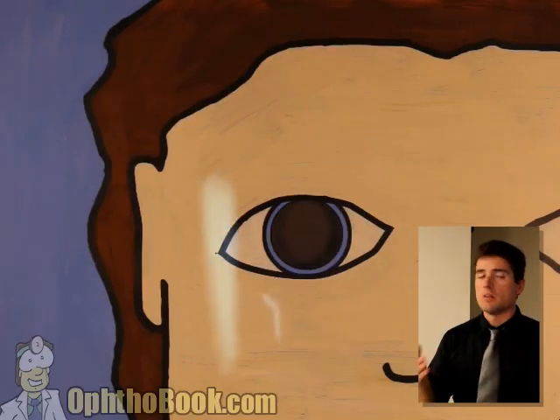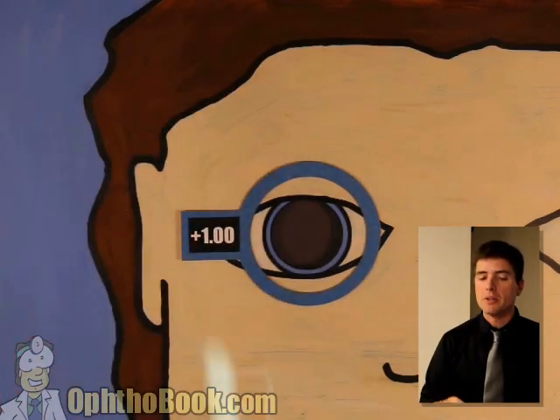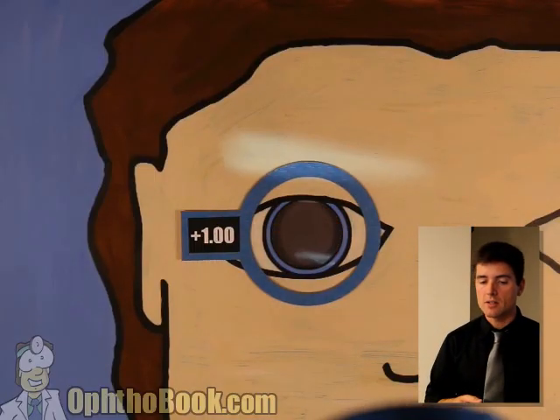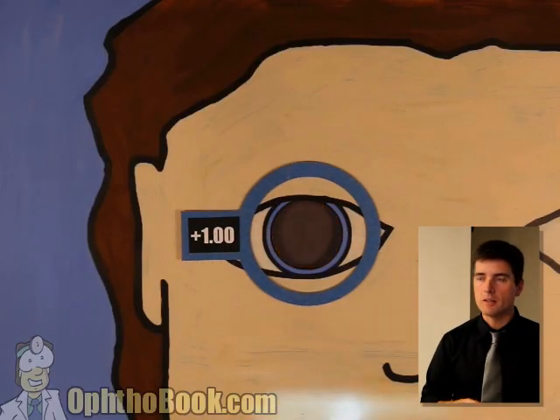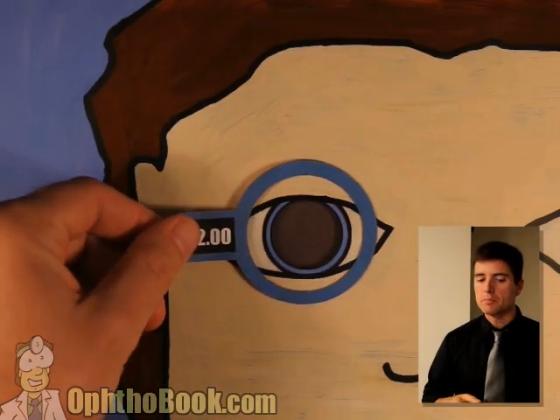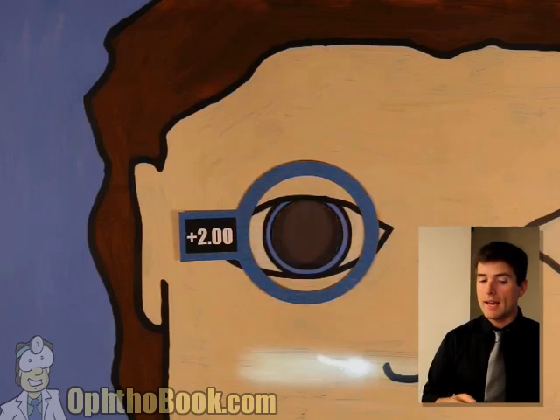Step one: start with width. Good. We can proceed to step two. Let's start adding some power. We'll add a plus one. We're still with — not quite there yet. Let's check the other axis — not quite there yet, we're getting there. Let's add another diopter of power. Plus two. It looks like we may have hit it here. In fact, I think we have. Let's check the other axis.